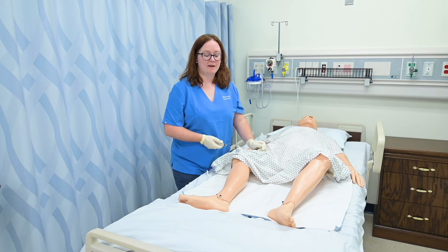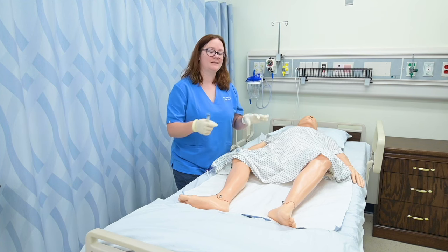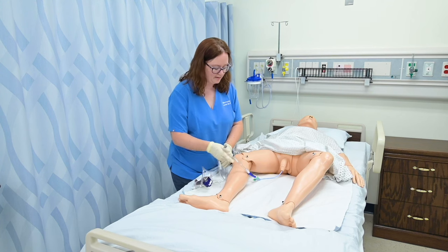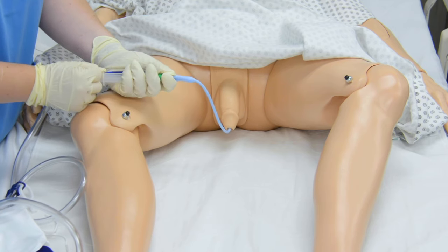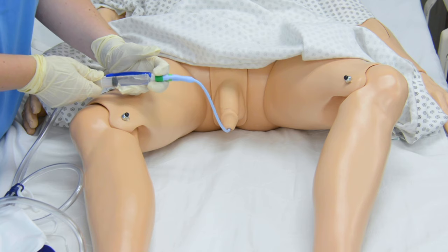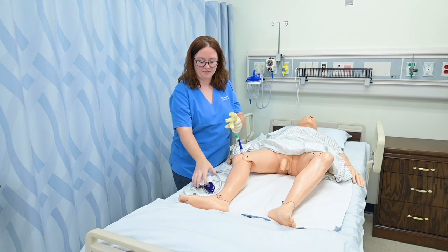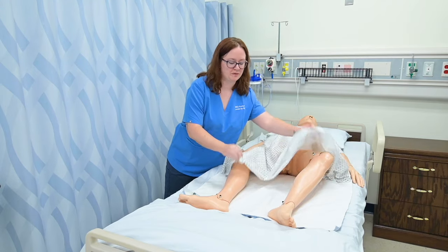Once it's ordered to remove a catheter, all I need is a 10-milliliter syringe and I might go ahead and grab an absorbent or waterproof pad, because sometimes just the motion of removing the catheter from the urethra makes some urine trickle out. I expose the patient, having already emptied the bag. I detach it from the bed and detach the tubing from the patient whether it's tape or an anchor. Then I simply insert my 10-milliliter syringe into the balloon port and aspirate or withdraw all of the fluid I put in — if 10 milliliters went in, 10 milliliters needs to come out. Then I simply pull it on out, wrap it up, and discard everything. If needed I provide perineal care after replacing gloves, then position my patient comfortably. That's how you remove a catheter.